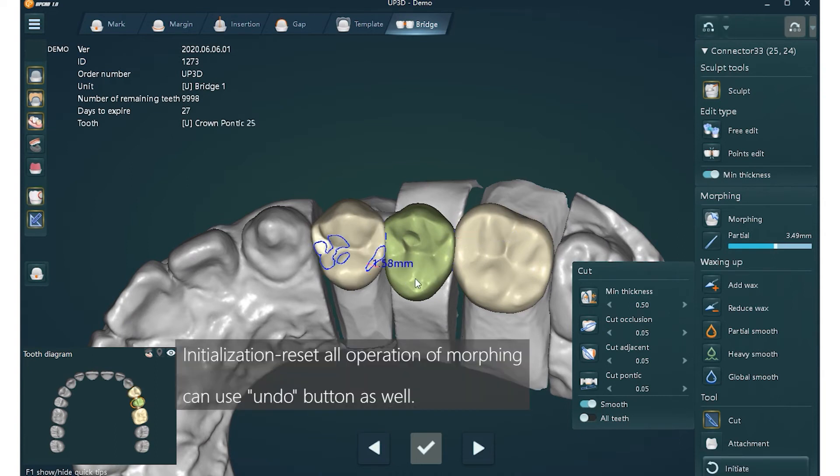Initialization resets all morphing operations. You can also use the undo button as well.